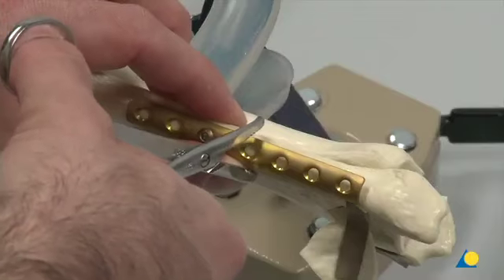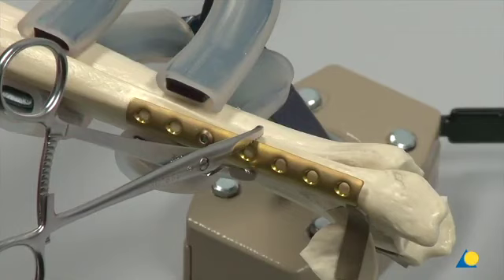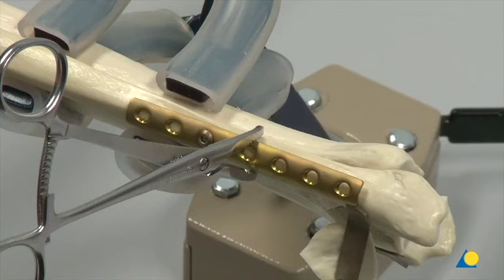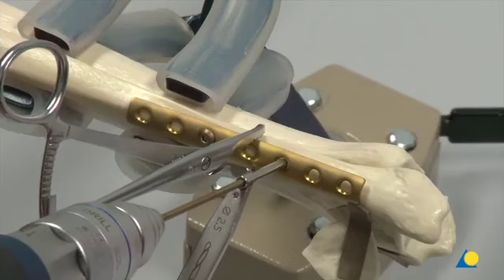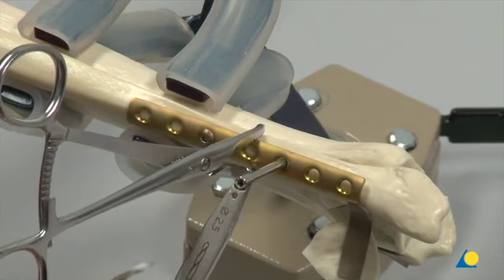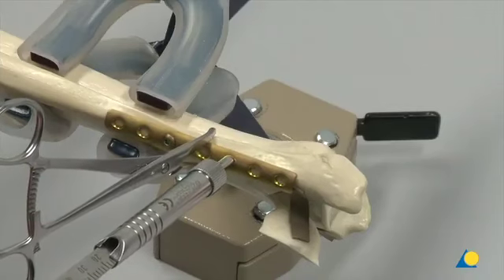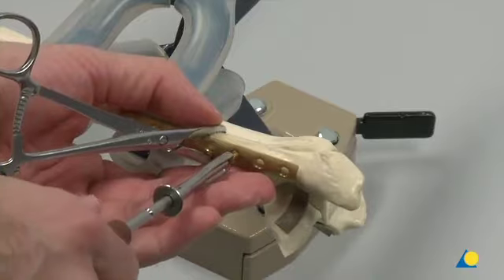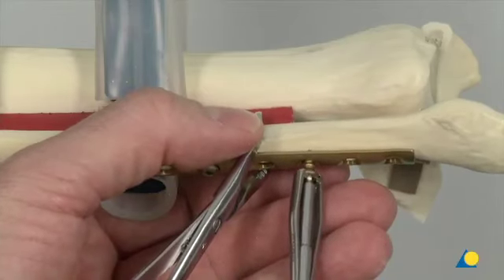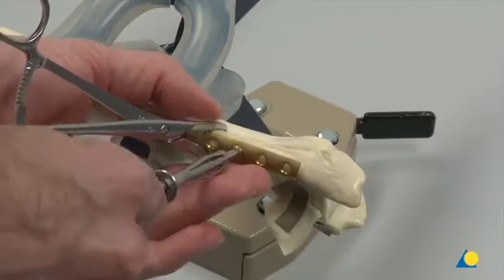A final fracture reduction is performed over the plate using the toothed reduction forceps. Pointed reduction forceps can also be used from a medial-lateral direction; however, this requires more soft tissue dissection. The 2.5 mm drill bit is used to drill eccentrically through the 3rd distal plate hole. The depth gauge is used to measure the required screw length. The 3.5 mm self-tapping screw is inserted into the drilled hole, resulting in axial compression. As the eccentrically placed compression screws are tightened, the head moves down the ramp in the plate hole and compresses the bone together.